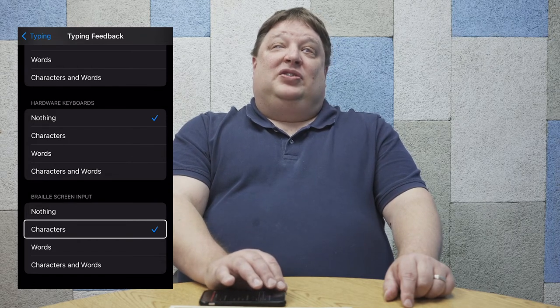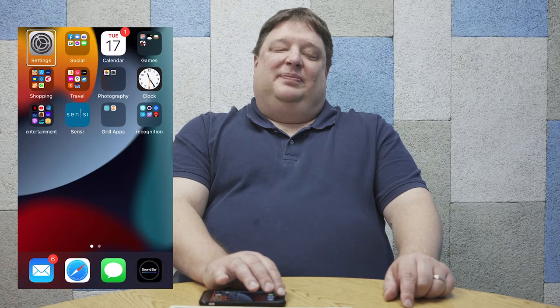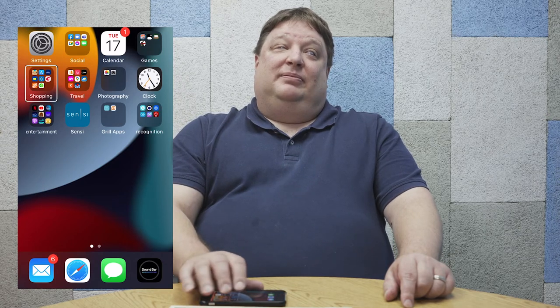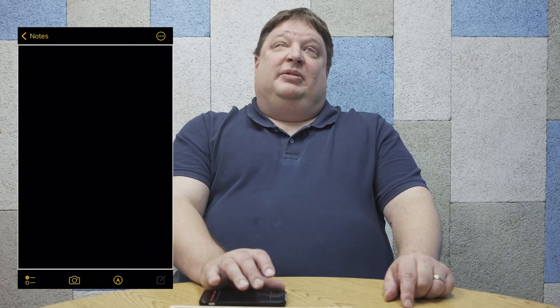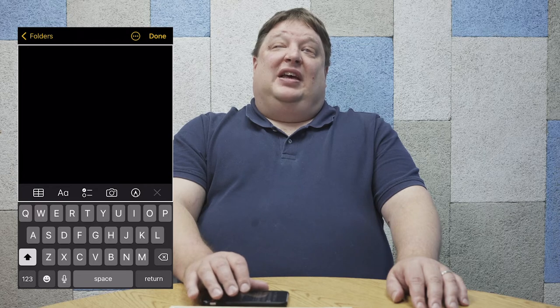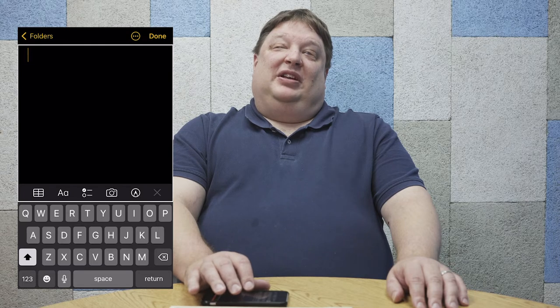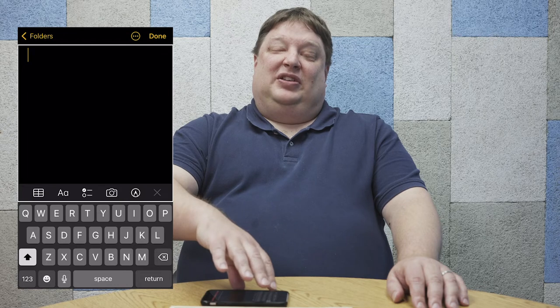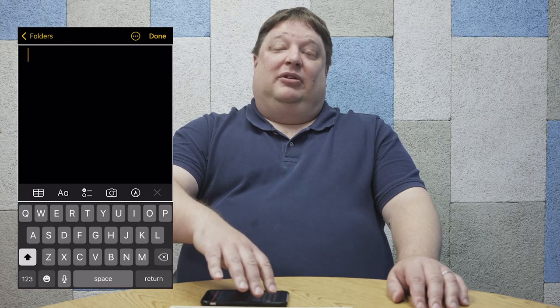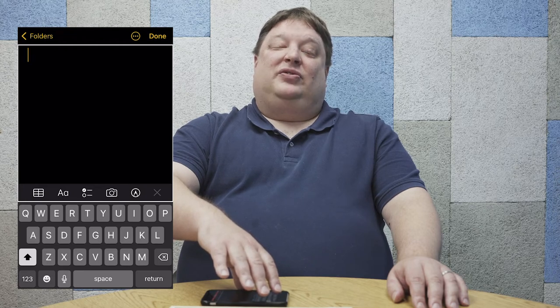Now we have set up Braille screen input — it's just that easy. Once we set up Braille screen input, we can start using it. So I'm going to go ahead and open a notes file here and demonstrate how Braille screen input works. Now our text field is editing, and we have our standard on-screen keyboard displayed on the screen. I'm going to take two fingers and rotate them on the screen, like I'm turning a knob to activate the rotor, and twist them until I get to Braille screen input.